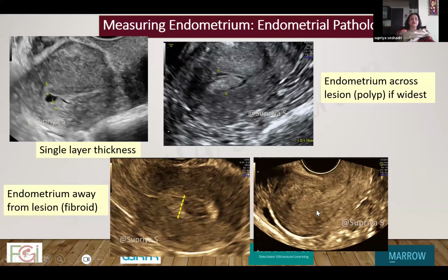And in a scenario like this, wherein this is adenomyosis, wherein the EMJ is not well seen, the borders of the endometrium are not well seen, IETA says write non-measurable, but I would think that if I wrote that, someone would think that I don't know how to measure. And so in these cases, what I do is I write, EMJ not well seen, endometrium not well defined. However, approximate measurement is so and so.